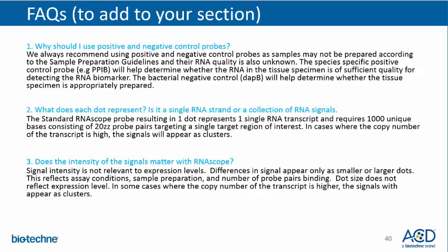Also related to the HALO software is people ask where they can access the software. Well, this software is available through Indica Labs, but also here at ACD we offer the service for HALO data analysis. There are a lot of questions actually coming up, and support at this point is chatting and answering them. Some more that are coming up are related to the magnification.